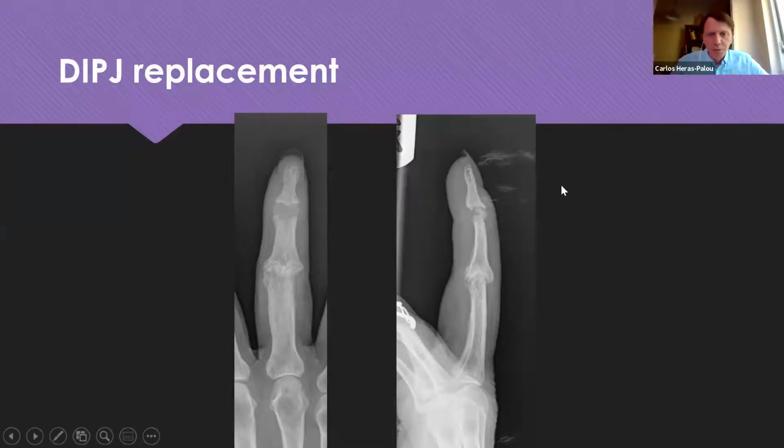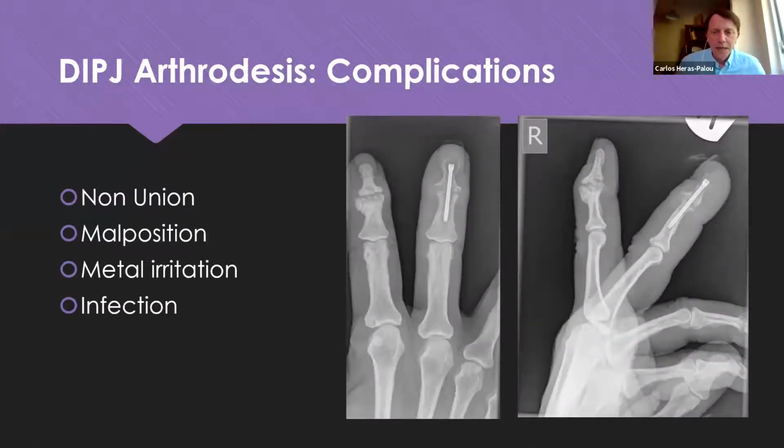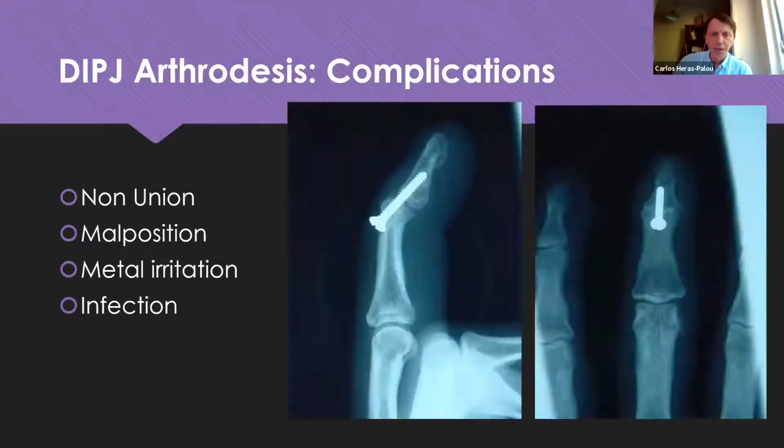Okay, let's move on from this. These operations are not difficult, but they're not forgiving. You need to get it right. Non-union using an intramedullary screw is very rare, actually, but it can happen, like in this case, which was interesting because the one we operated on didn't unite, but the next one that we didn't operate on fused spontaneously. Interesting situation, but I just took the screw out. That was a 2.2, put in a 3 millimeter, and then with a bit of compression, it settled.